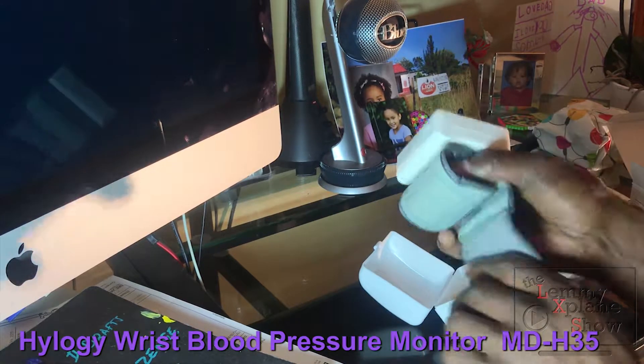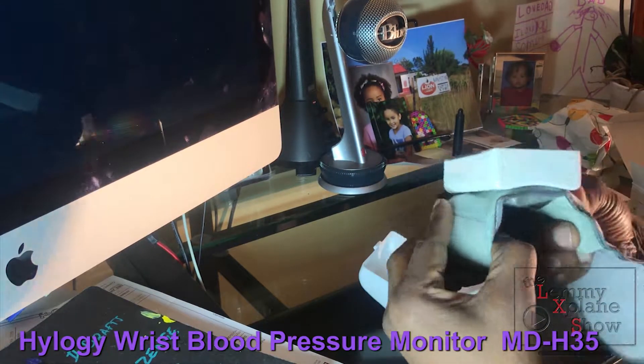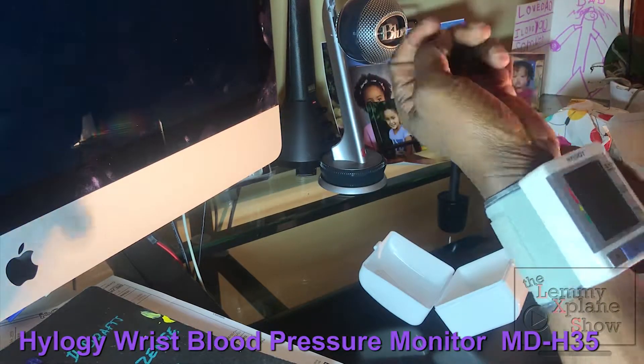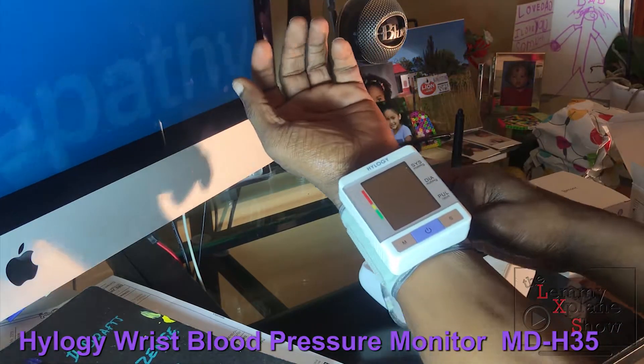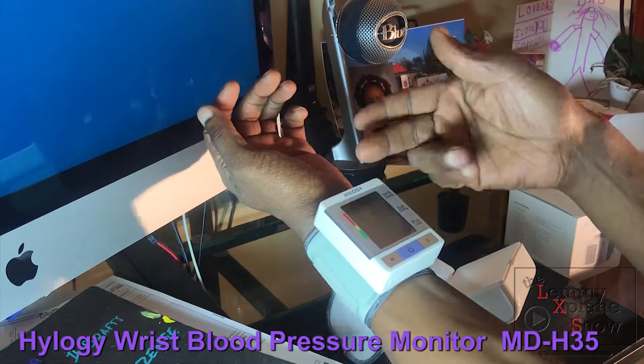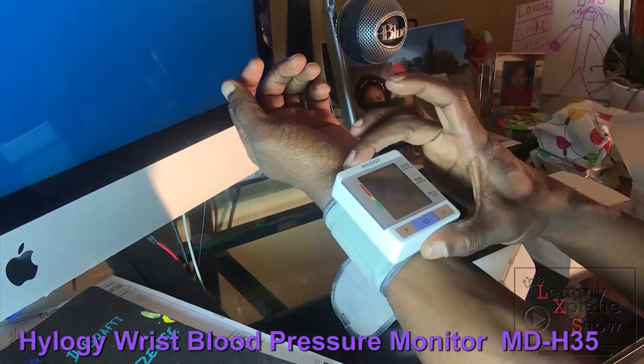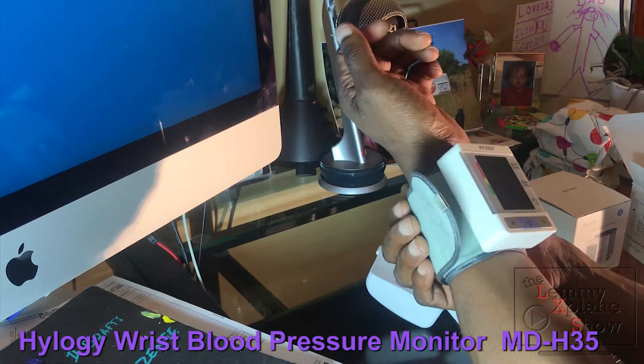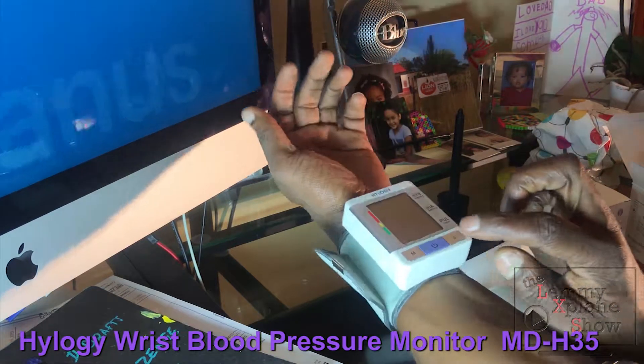I'm going to put on the blood pressure monitor now. What you do is open the cuff and slide it over your hand, making sure it's on the front side. You want to make sure that the monitor is in line with your heart — that's the position recommended in the manual.